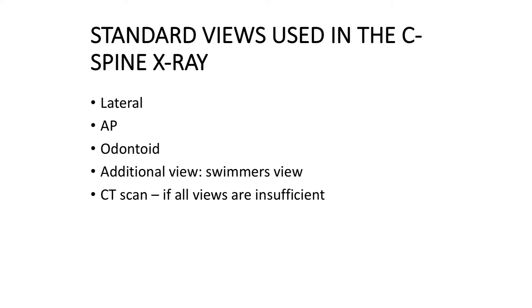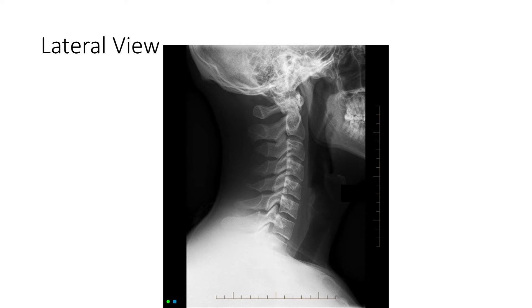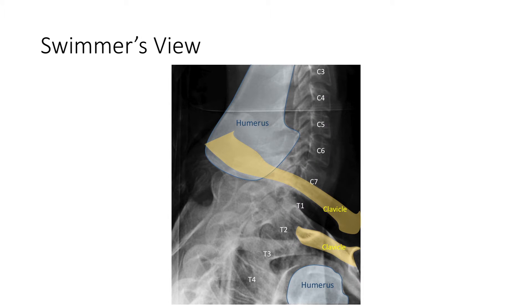We will start with an approach to the lateral view. Starting with the coverage, we have to make sure that all the vertebrae are visible, from the skull base to T1. If T1 is not visible, you can repeat the X-ray or obtain additional views such as the swimmer's view, which is an oblique image with humeral heads projecting away from the C-spine. Other views can be obtained by applying downward traction to the arms. If these multiple views do not show sufficient coverage, then a CT scan is indicated.